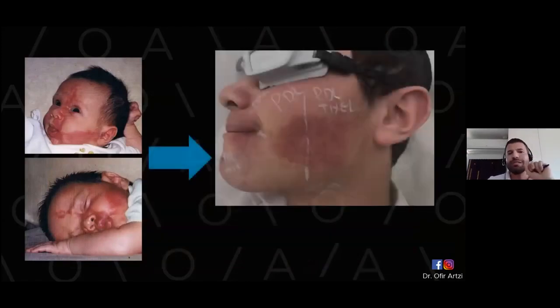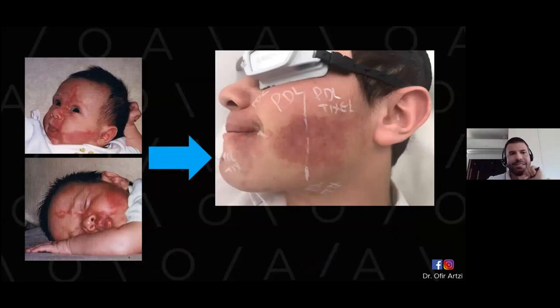This is port wine stain. This is a patient that came to us. He was treated when he was a child by pulse dye laser, several studies. This is his picture when he was 15. We tried just pulse dye laser. It wasn't very efficient. And then we decided to add rapamycin, which again, this is very controversial if it assists.